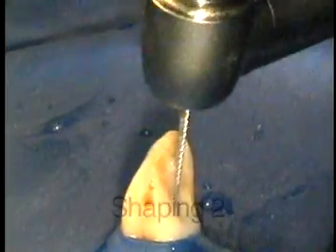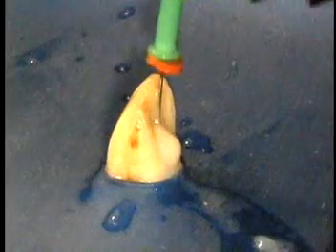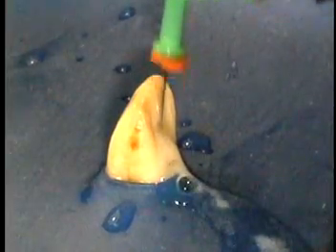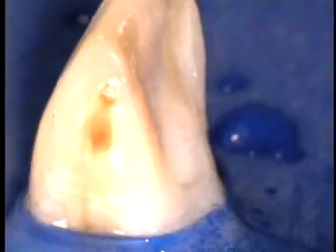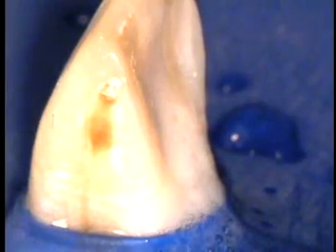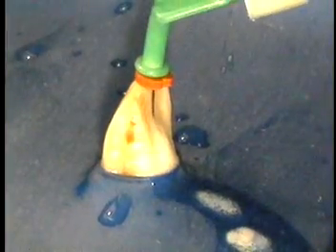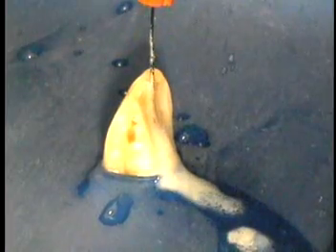This technique is now repeated with the shaping file number two, that technique again being lubrication with file-ease, file, irrigation with sodium hypochlorite. And it's also repeated with the third shaping file. You use each file for about a minute, or until the file is very loose in the canal.